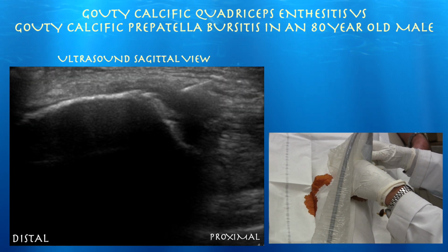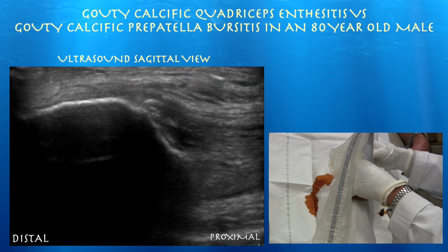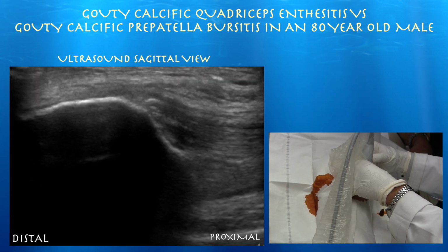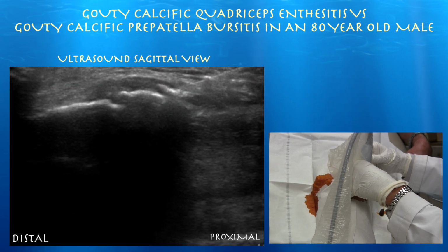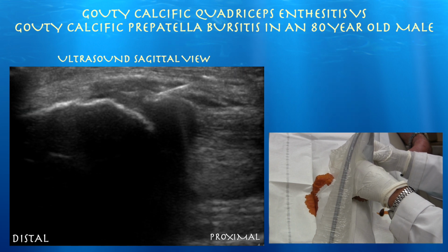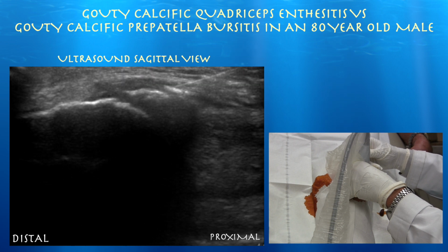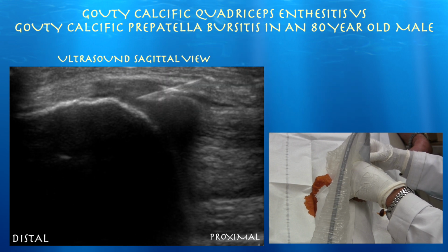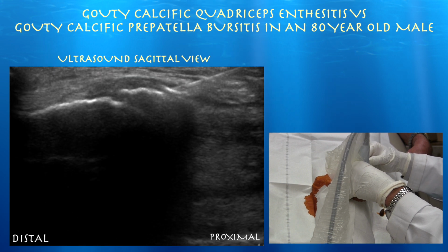Just injecting lidocaine superficial. Again, we're just injecting more lidocaine right on top of it. Now we're just going in and out of that calcium deposit. Part of why we mechanically break off these deposits is that you make it easier for the body to resorb it, just increasing the surface area. That's why I'm doing this. Also may get a little bleeding here and stimulate some healing.